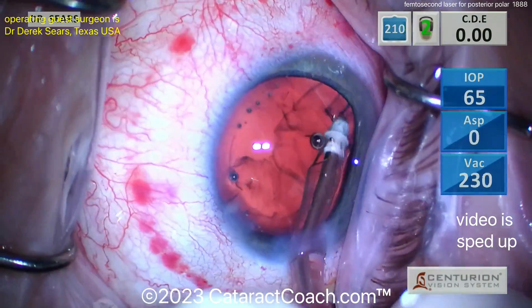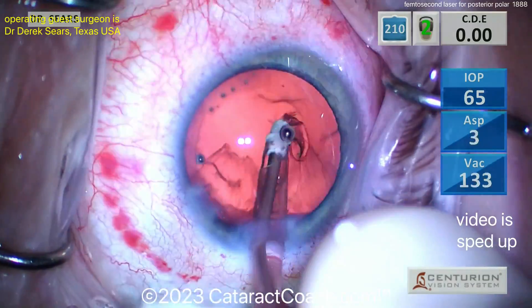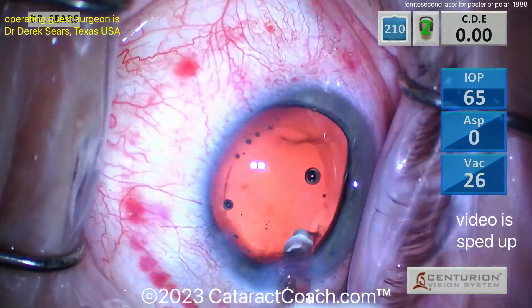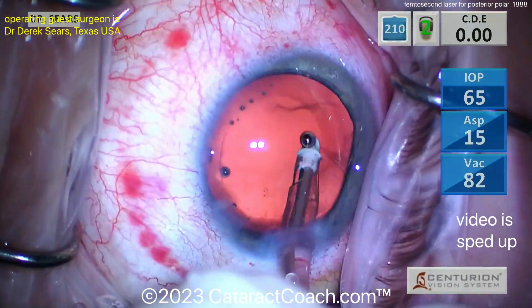You can see the round ring of subconjunctival hemorrhage left by the suction ring from the femtosecond laser — that will obviously go away in a couple of days. Now subincisional cortex, removing that very nicely done, cleaned up.